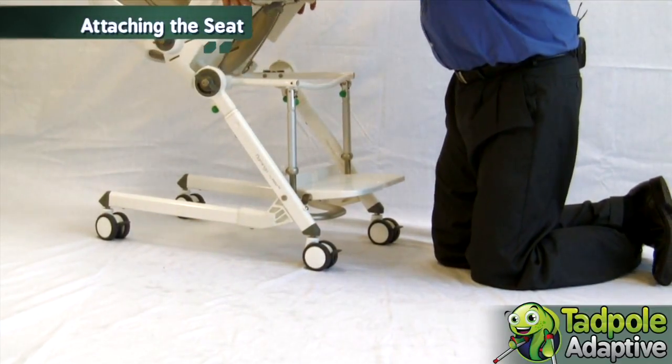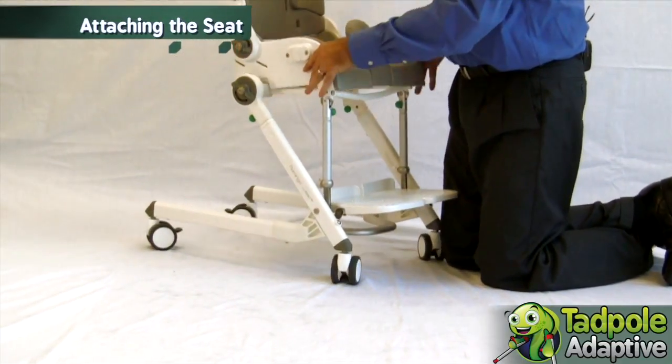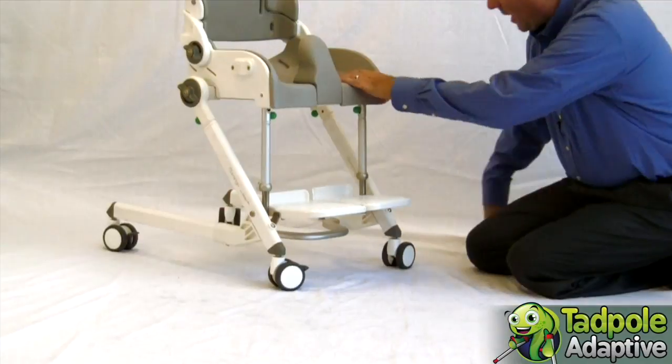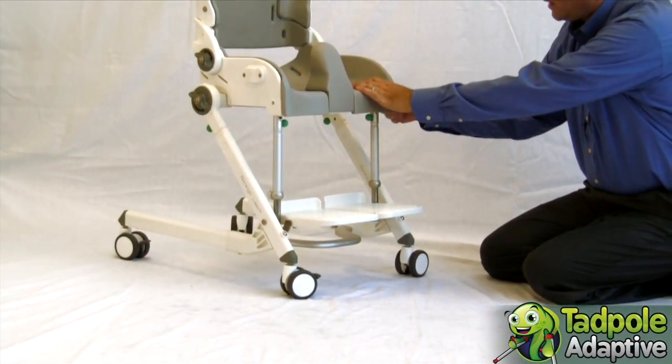To attach the seat, simply line up the white clips to the rear, lock in place, and fix the knobs.